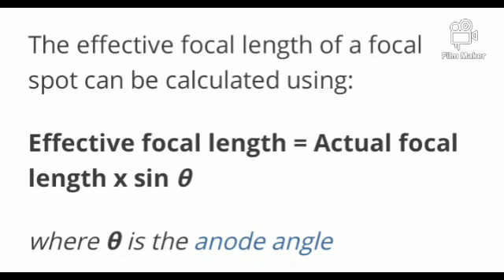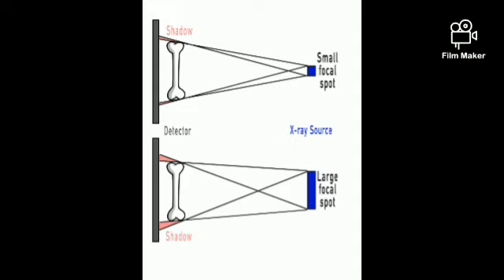Next, our focal spot size is expressed in mm, and it ranges from 0.3 mm to 2 mm. Basically we have focal spot sizes of 0.3, 0.6, 1.0 and 1.2 mm, mainly used for radiological purposes. The major effective focal spot sizes are based on our spatial resolution. For mammography we use focal spots from 0.3 mm to 0.6 mm, and for diagnostic radiology purposes, we use 1 mm to 1.2 mm.